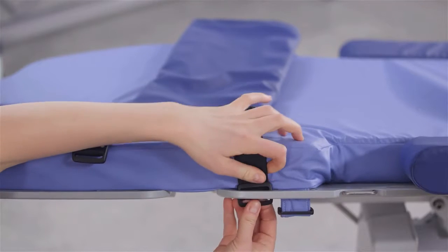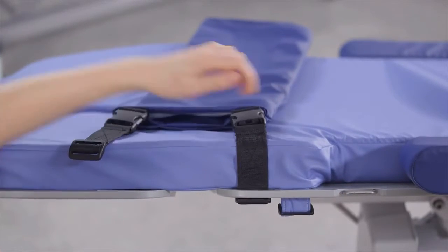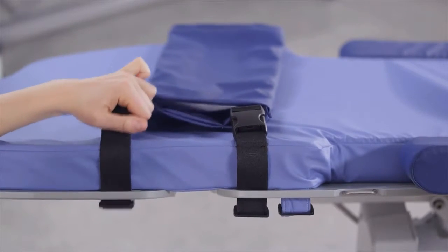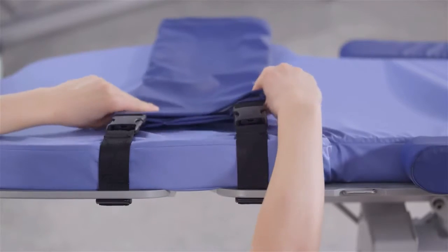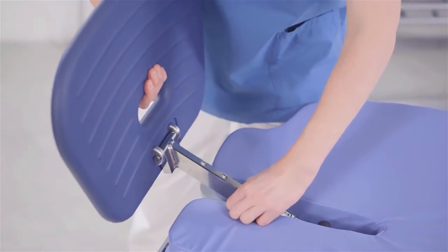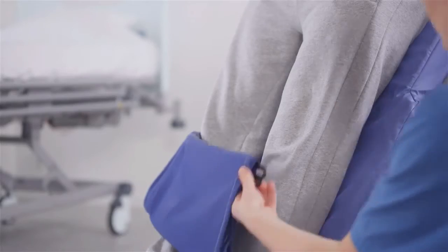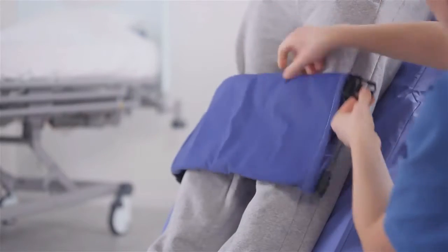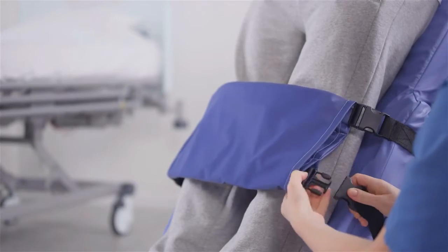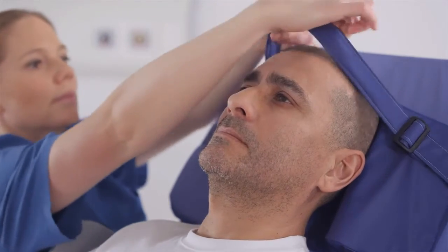Secure the safety straps on the frame by locking the buckles. Press the spring lock to release and remove the foot support. Secure the safety straps for the patient. Position the head safety strap.